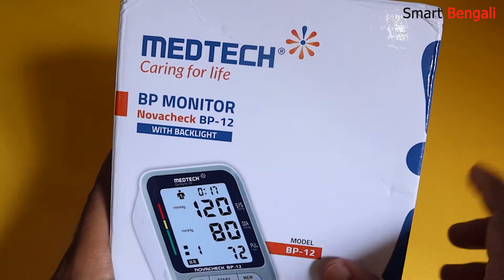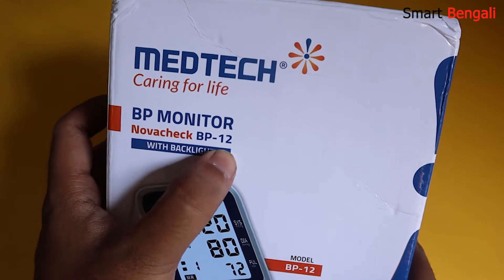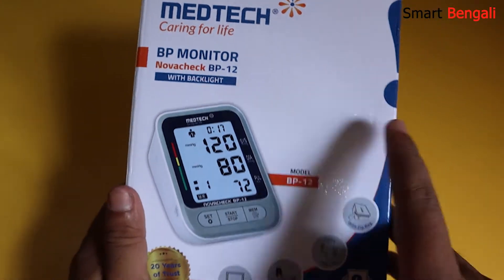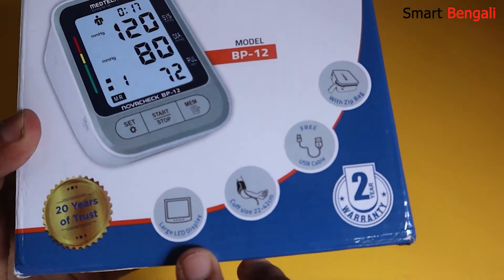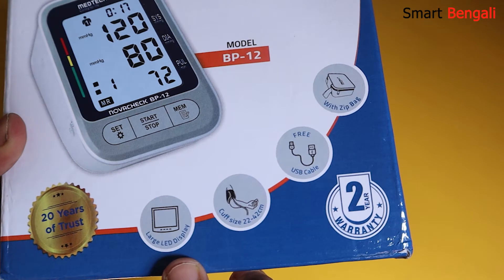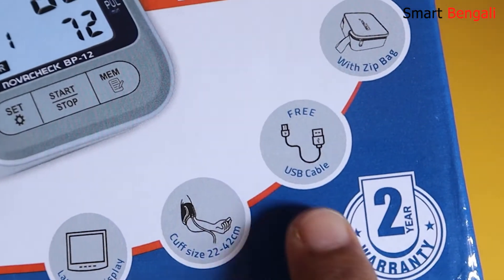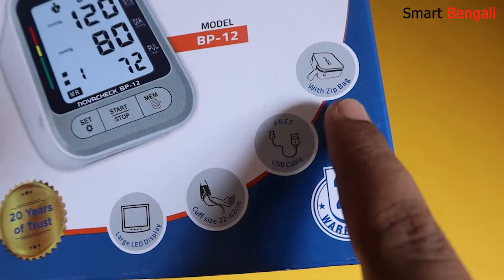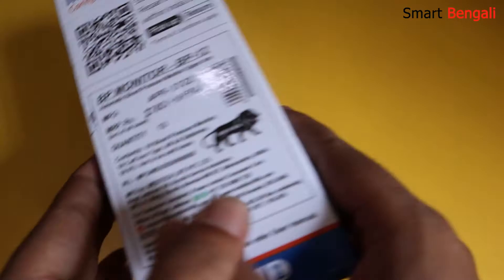Medtech — caring for life. This is the model name: Novacek BP-12. It comes with backlighting. Here we have some features of the machine — a pretty large display with backlighting, and the cuff size is 22 to 42 cm, which is more than sufficient. A USB Type-C cable is included, and we have a zip bag. The great thing is it comes with 2 years of warranty to give you peace of mind.